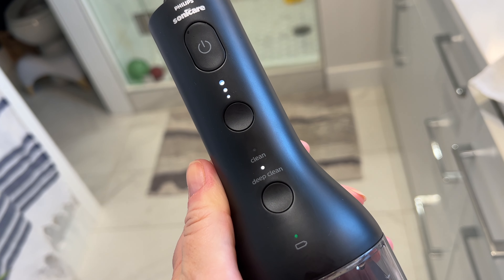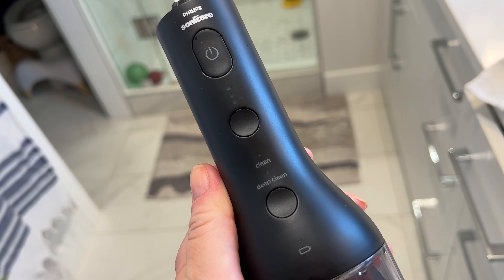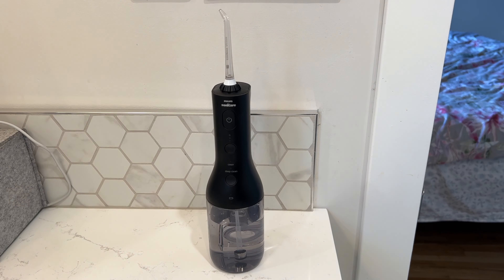You should get about 25 uses per charge, with each session lasting about a minute or so. There is a battery indicator on the bottom of the handle that shows a simple light when you activate it — if it's solid green, it's full. The charging time isn't disclosed in the manual, but when mine was running low, I would just plug it in before bed and it was recharged by morning.